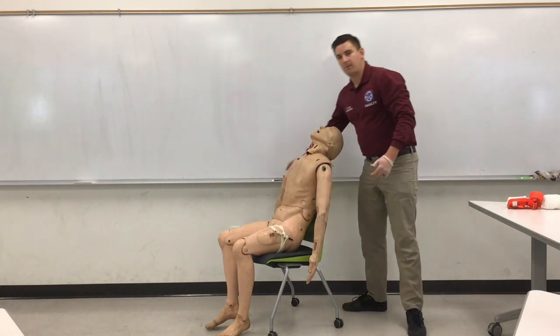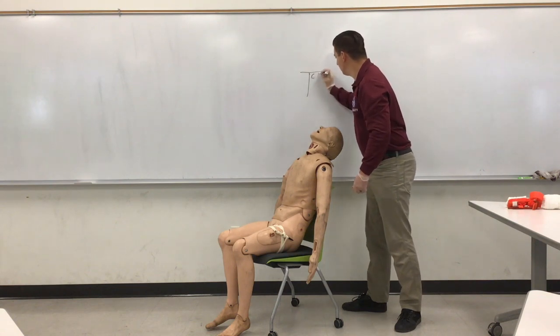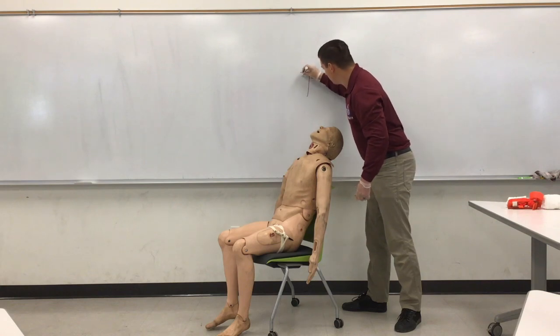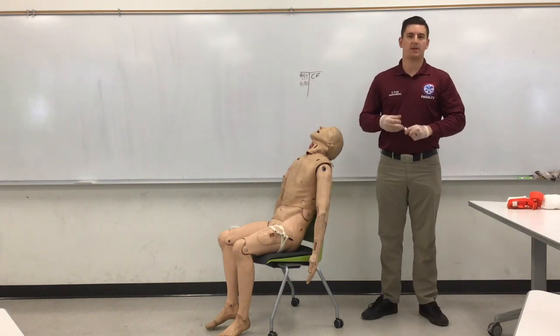Now it's time to document. I will put onto the patient a T. I will put my initials, the time, and the date. That is how to make a triangular bandage tourniquet.